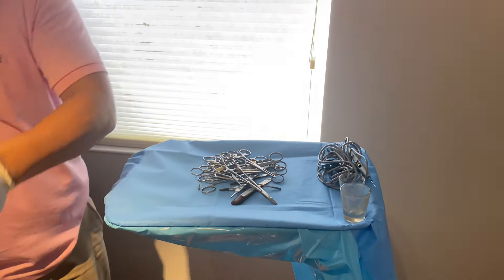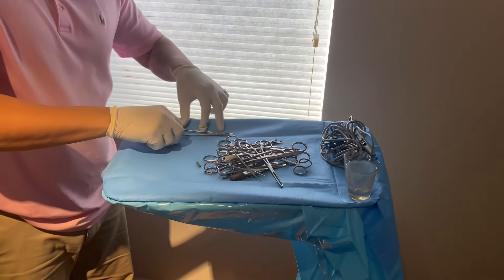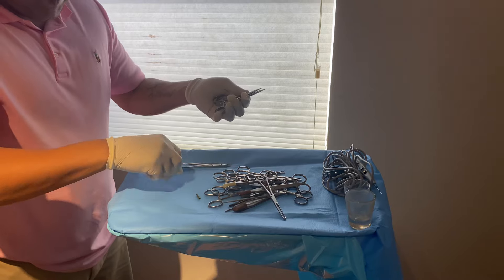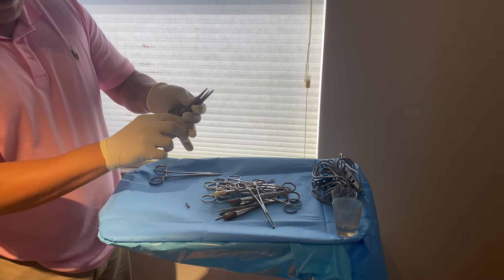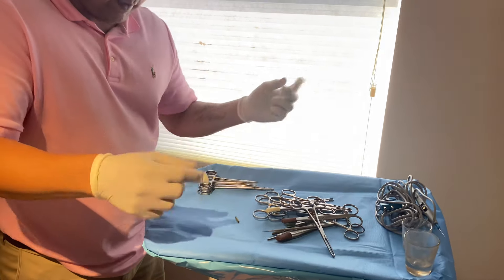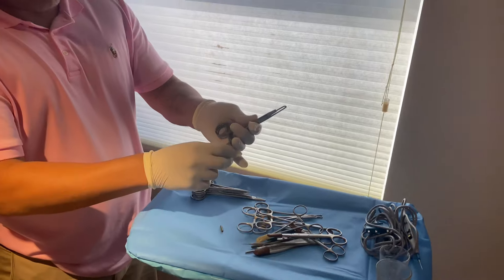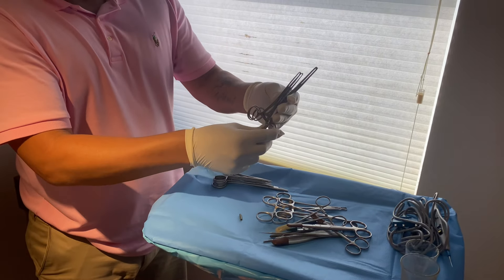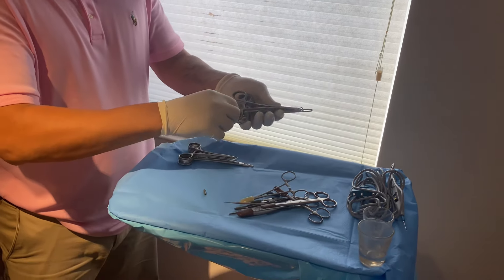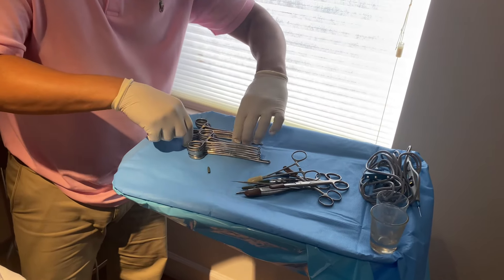I'll lay the instruments on the sterile towel and fold it in to cover the tray when I'm done. You have five hemostats — one large one, three fine-tip, and then one extra that Dr. Stein will use. I always arrange them like this, but everybody has their own preference. Then you have these instruments — you'll have three of these. Dr. Stein tends to add instruments rather than remove them. And you will always have four ring clamps.